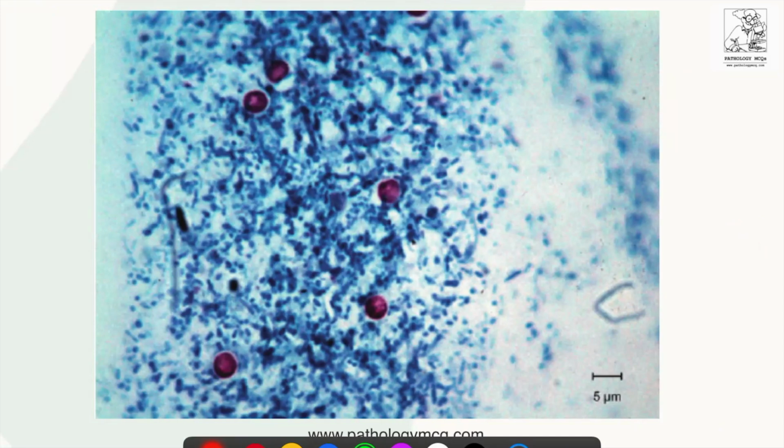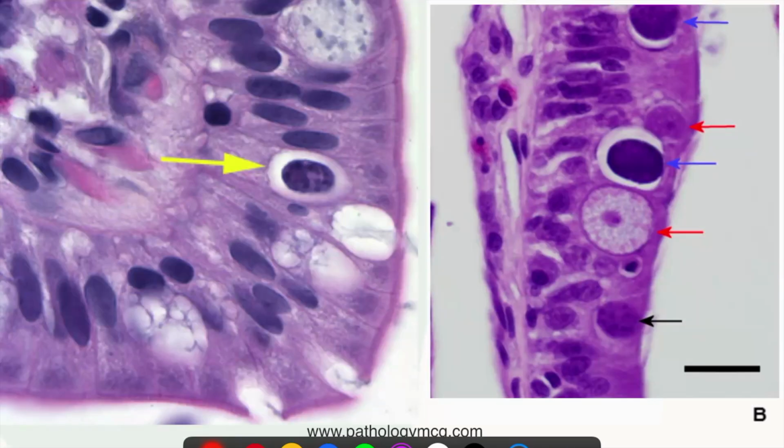So what is the diagnosis? The diagnosis can be done by using the stool test. Sometimes these oocysts of Cryptosporidium can be present in the stool like this, and when you stain it with AFB, these might get highlighted as you can see here. And if it's not evident in stool, a PCR can always be done for detection of these organisms.